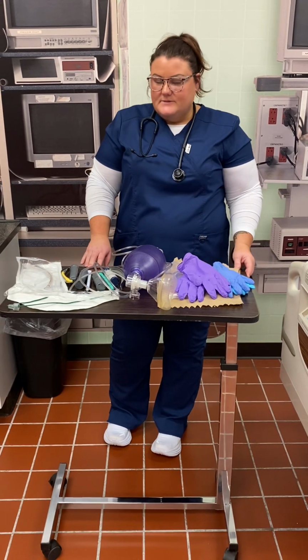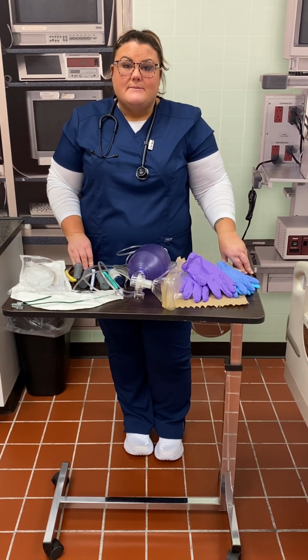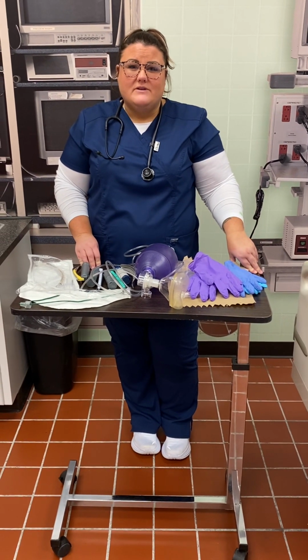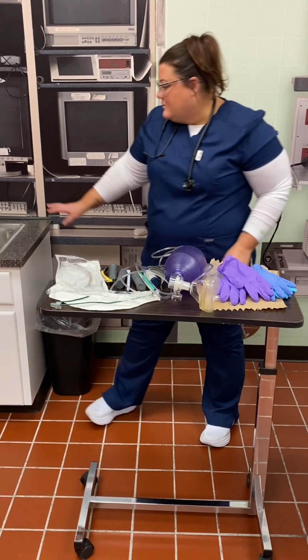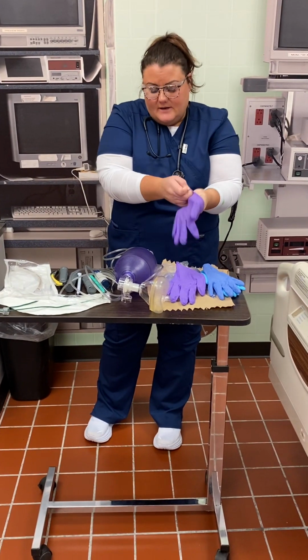So first things first, I'm gonna look at my patient's chart, looking at my name, date of birth, MRN number. I'm gonna look at my physician orders, which state that my patient needs to be extubated. I'm looking at my chief complaint, code status, chest x-rays, labs, and ABGs. So I'm gonna go ahead and wash my hands, get some gloves on.